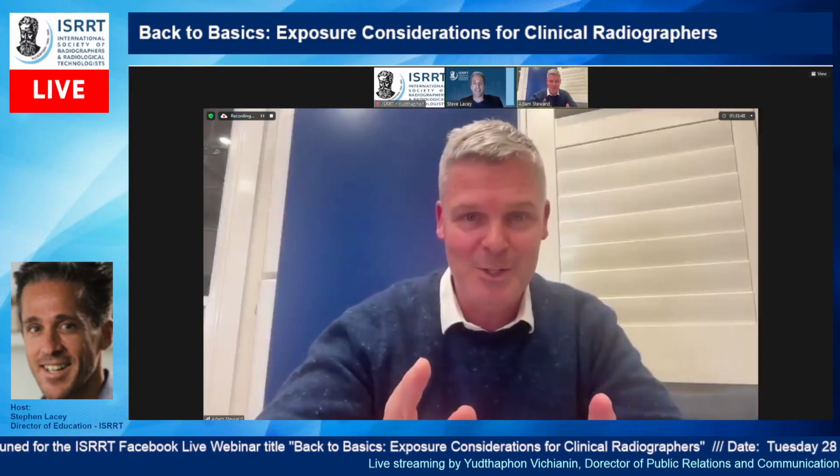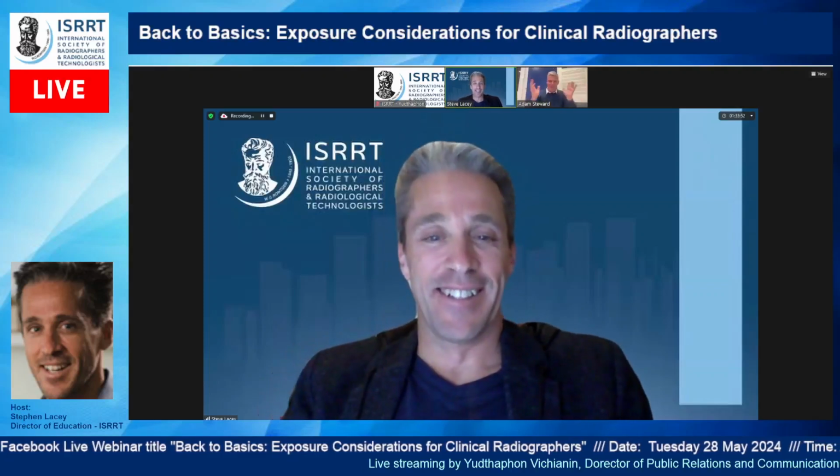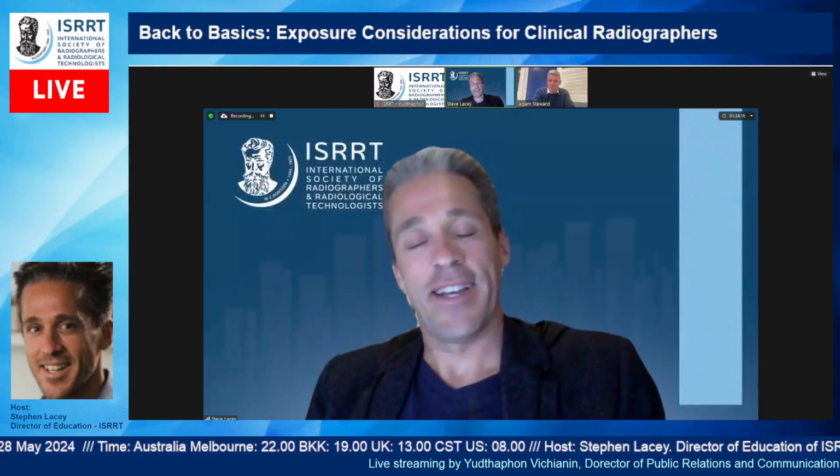Until after you've collimated correctly. And then put the filter on and do everything after you've collimated. It's interesting because I always teach my students to collimate first. Set the exposure, walk in the room, collimate to a preset size. We've got auto sensing now. Preset to a set centimetre size, and then don't touch it because you know it's going to fit. You just need to position correctly. And that's a good way to keep yourself on track to collimate effectively. That's exactly right.